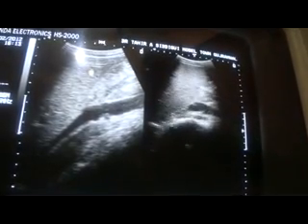It appears to be elevated, but no mass is seen posterior to it. However, with pressure, this is the mass. Now the mass comes into view, and you can see that it is not only elevating the IVC, it is elevating the proximal aorta as well. This is the mass.